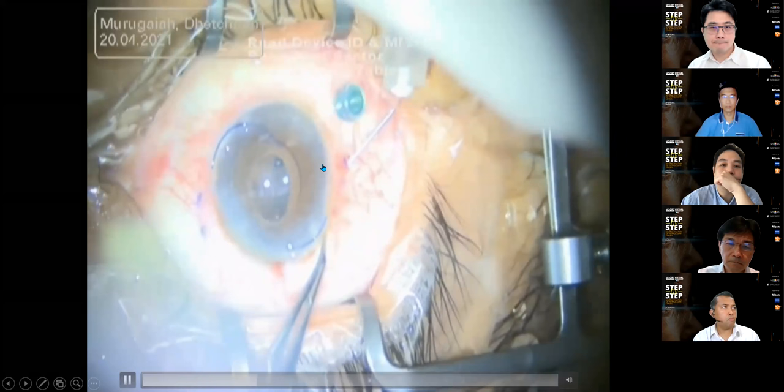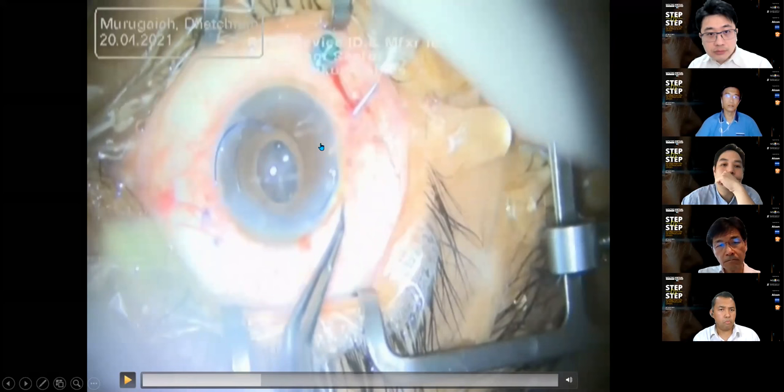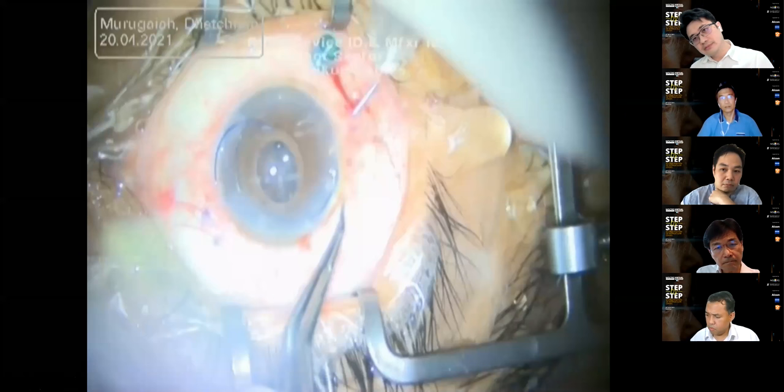What happened is that the needle is not perpendicular to the ocular surface and the needle has caught the peripheral part of the iris root. In this case, if you use a fairly big bore needle, you can easily see that. But if you use a small needle like a Prolene 10-0 needle, a fine needle, you might miss that. Another thing that might happen is when you didn't catch your iris, but you entered the sclera obliquely, anteriorly, then your fixation point might not be at 2 millimeters as you planned. It'll be less than 2 millimeters.